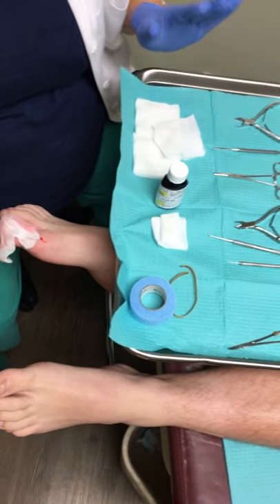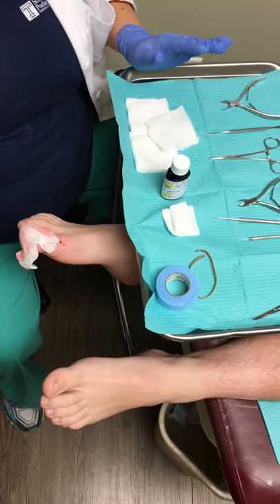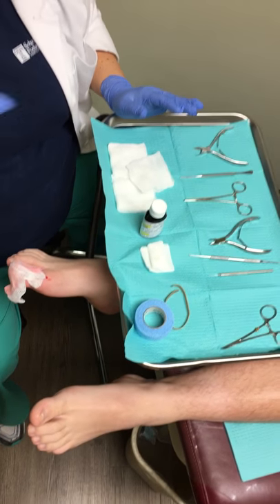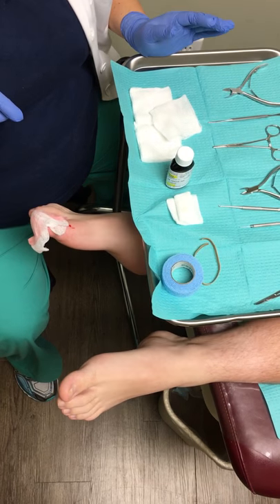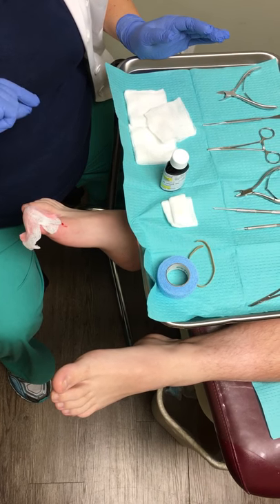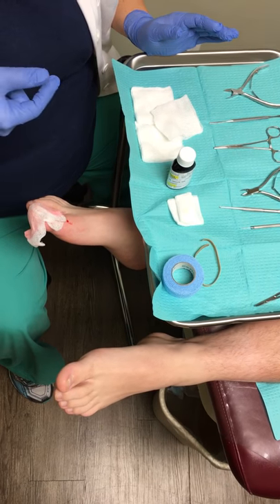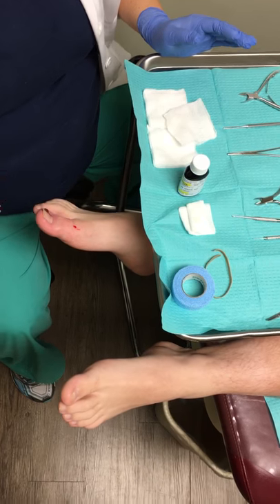So we've done our digital block at this point. We are going to do a right hallux lateral matricectomy, which is removing the nail section of the lateral border. And then we're going to use phenol acid, which is a chemical, to help burn the root or the baby cells — the matrix cells of the nail corner.